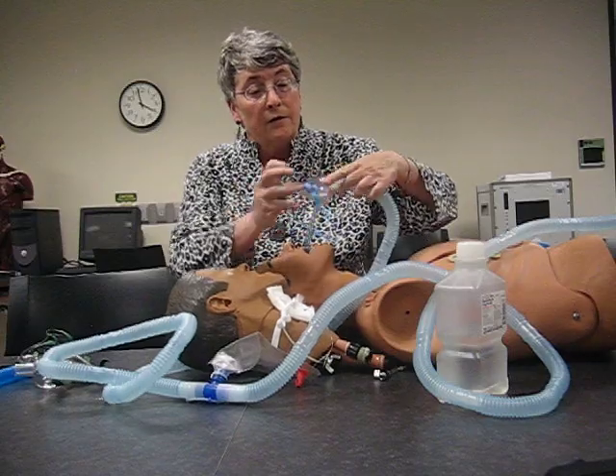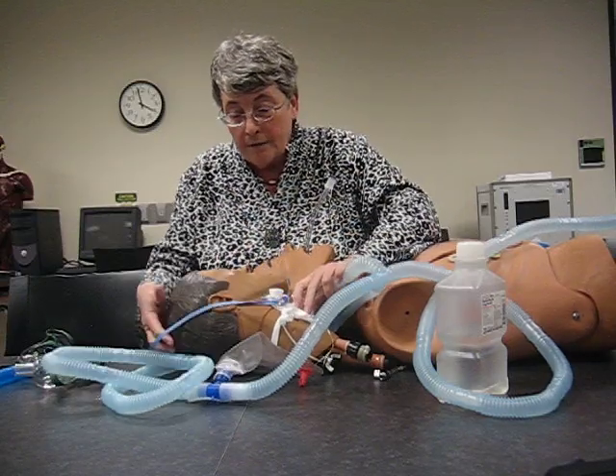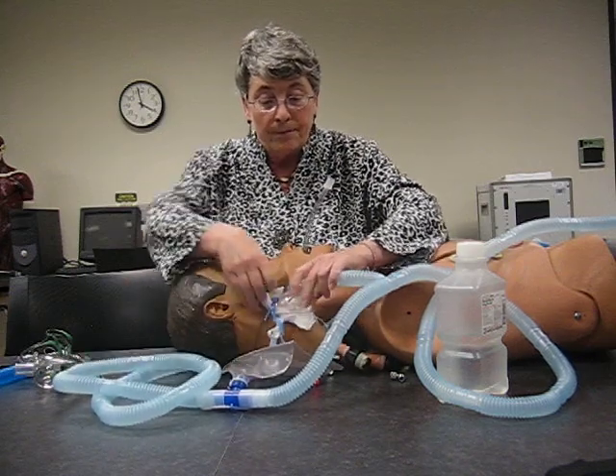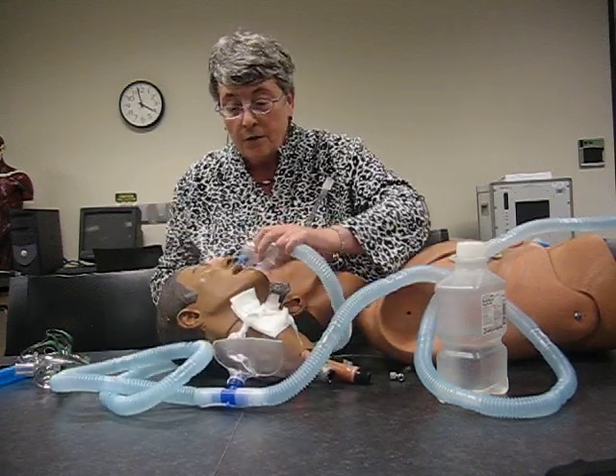Hello, Mr. Head. I'm going to give you 40% oxygen now. I lift his head, and this goes around his neck, so it's loose enough that if he turns his head, he's comfortable. And that is how we gave Mr. Head a trach collar.